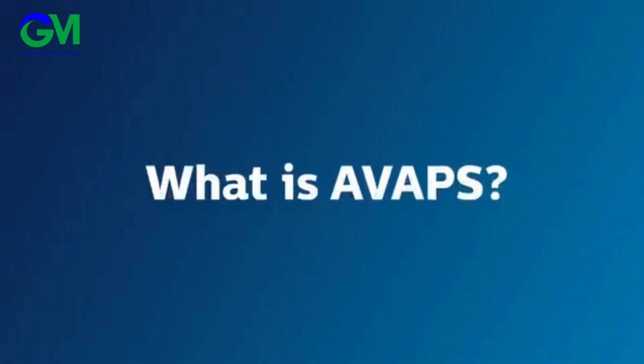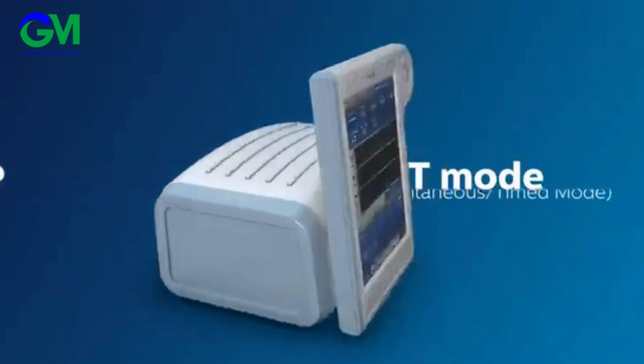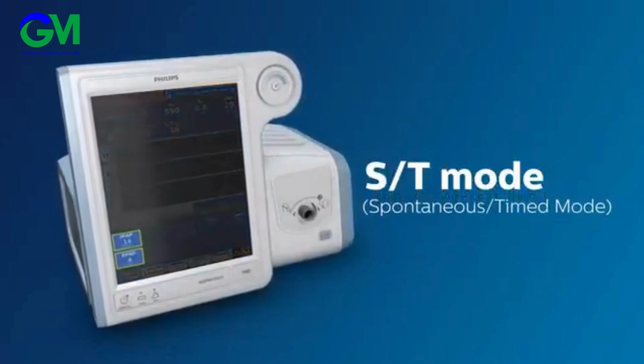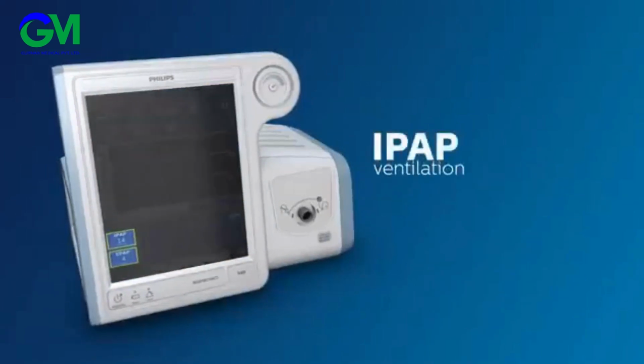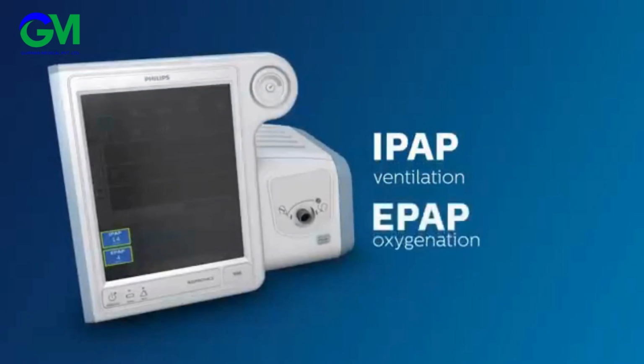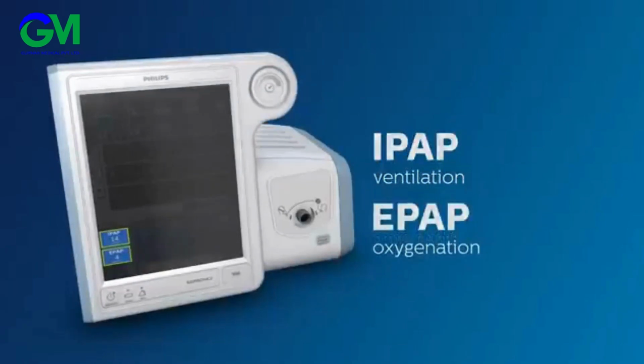To help understand how uniquely revolutionary the AVAPS mode is, let's compare it to another great mode, the ST mode. In the ST mode, IPAP and EPAP values are set here. The IPAP is set to manipulate and improve the patient's ventilation, while the EPAP control is adjusted to help improve the patient's oxygenation.